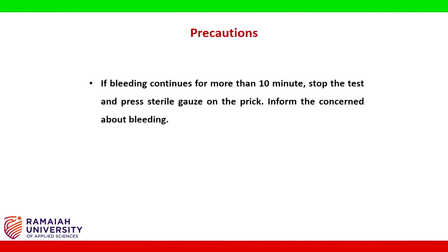Precautions: if bleeding continues for more than 10 minutes, stop the test and press sterile gauze on the prick. Inform the concerned person about the bleeding.